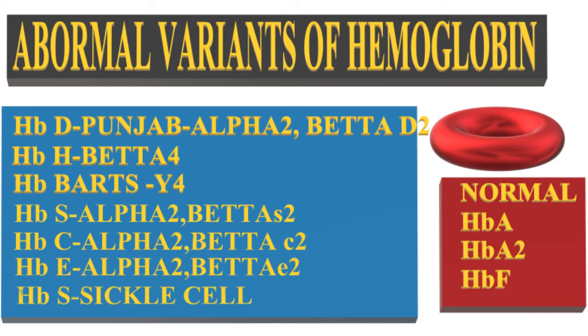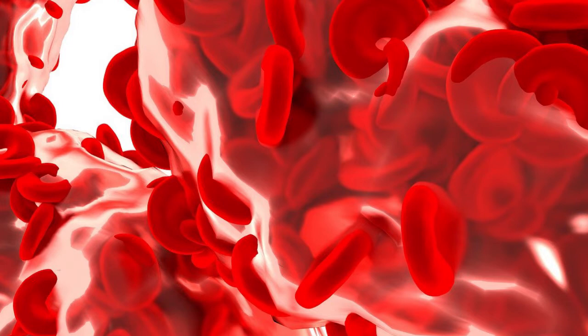Abnormal hemoglobin variants include Hemoglobin S, Hemoglobin E, Hemoglobin C, and Hemoglobin D. The amino acid substitution in these variants alters the net charge, causing inaccuracy in charge-based methods of HbA1c estimation. Any mutation involving the particular epitope in a variant hemoglobin will interfere with immunoassay-based HbA1c methods.